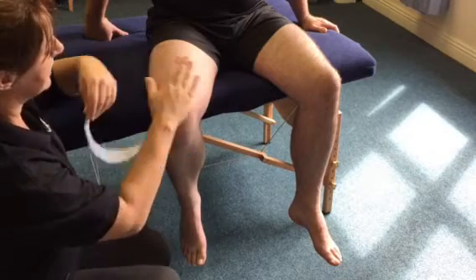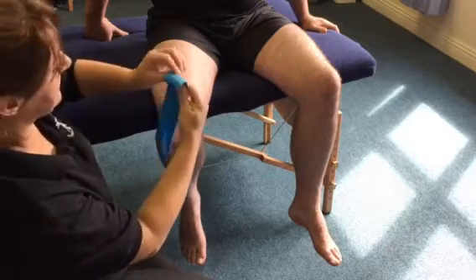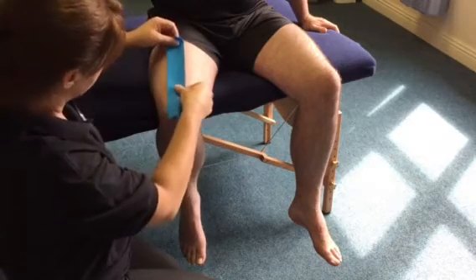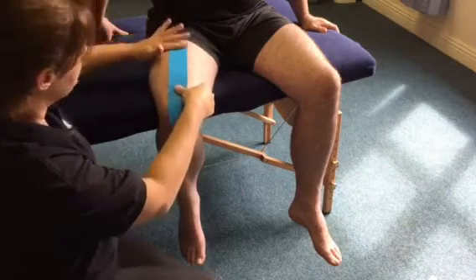With the muscle in a slightly stretched position already, I'll take off a little piece at the top — that's going to be called your anchor. You're going to stick that onto the leg with no stretch.